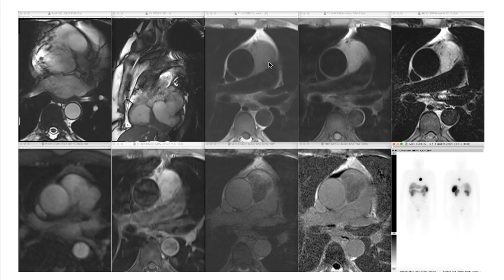So in the fibroma, it goes into that collagen. Because it's mostly extracellular space, it's just going to sit there. The washout rate is very, very slow. Whereas here, the washout is very, very high. So we don't maintain a lot of concentration of GAD at 10 minutes when we do delayed enhancement. And then here's an example of the octreotide scan, where it lights up like a light bulb, and that's diagnostic.